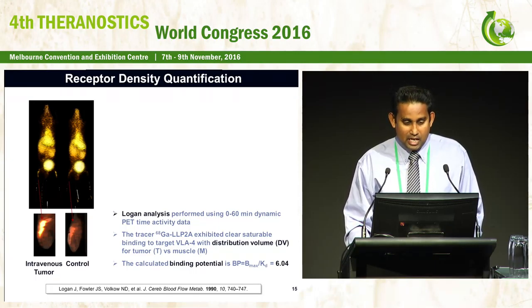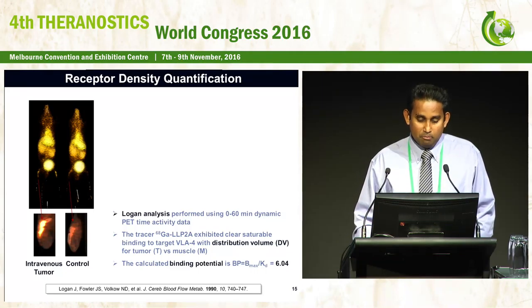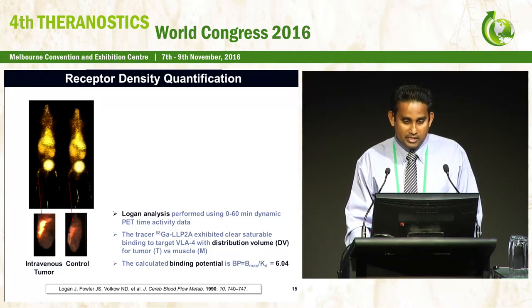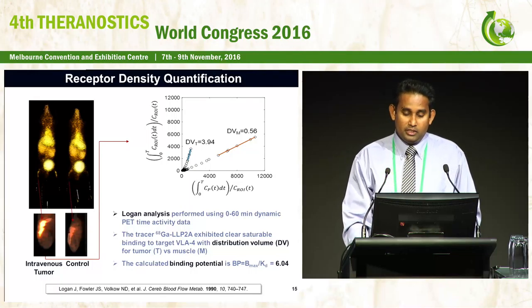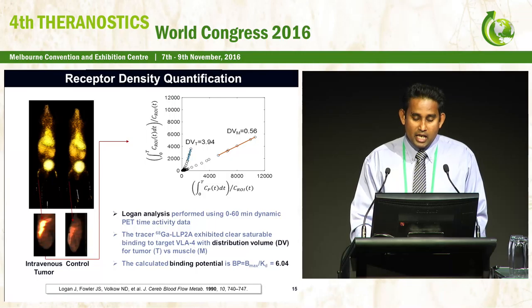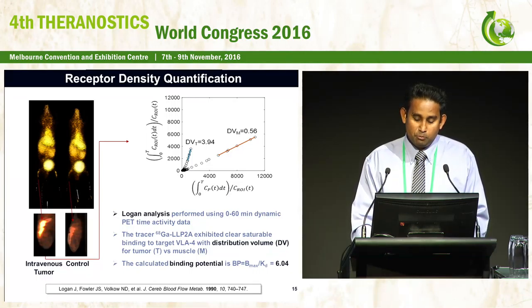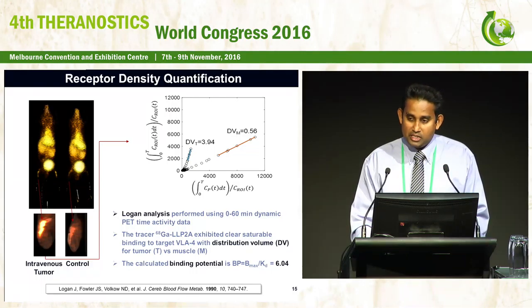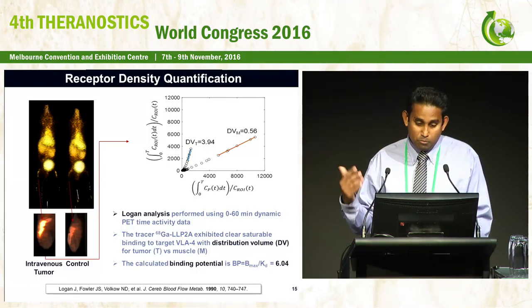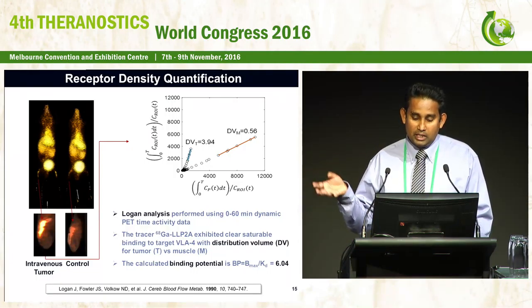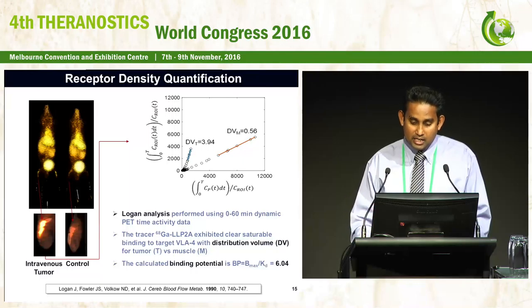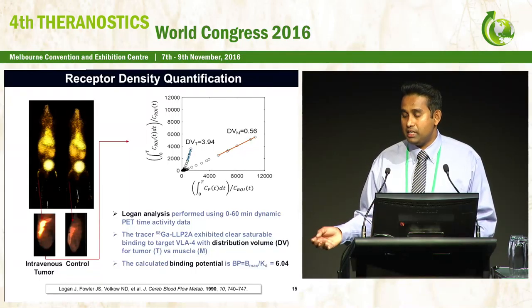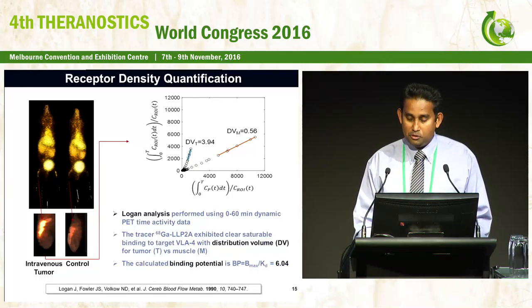With the PET dynamic data, we have performed in-vivo receptor density quantification using Logan analysis. The distribution volumes of tumor versus muscle were calculated. The most important data from this work is the binding potential in vivo, which is about 6.04 for the intravenous tumor. Notably, all three non-treated tumor models show similar values. In future therapeutic studies, we can compare changes in binding potential to assess treatment response.